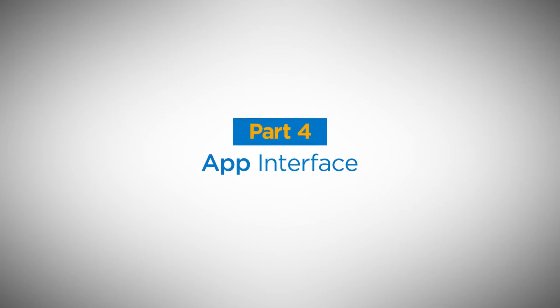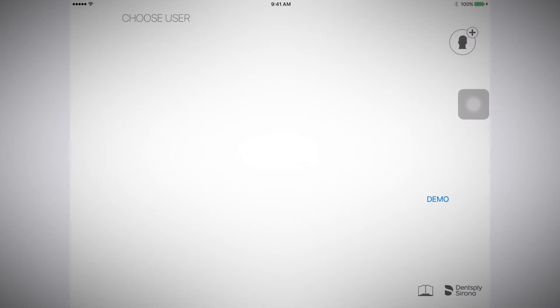App Interface. To get started, open the app and create a new user.